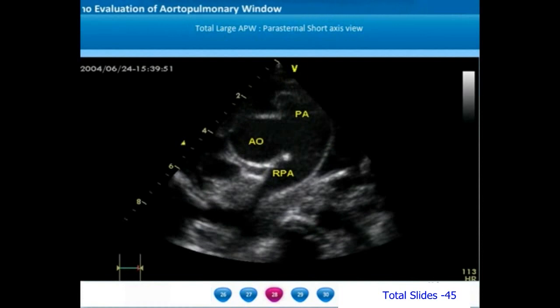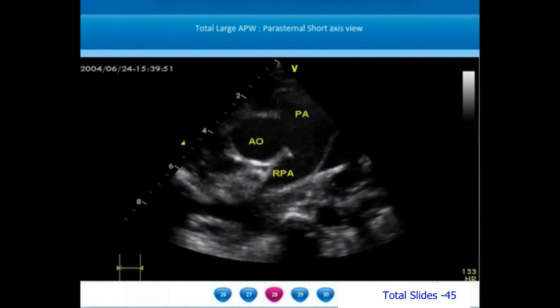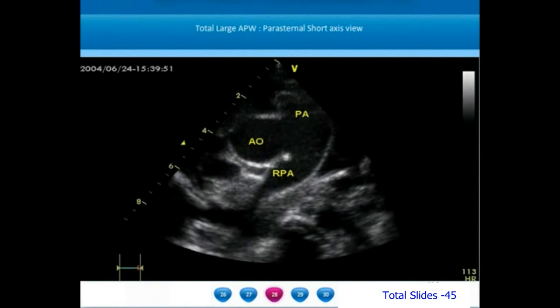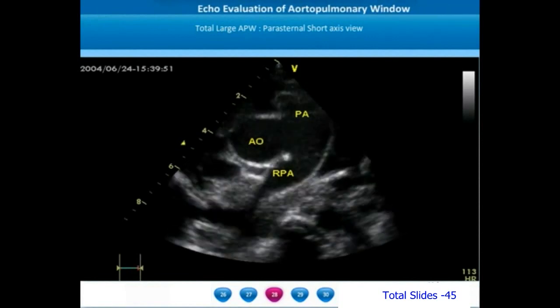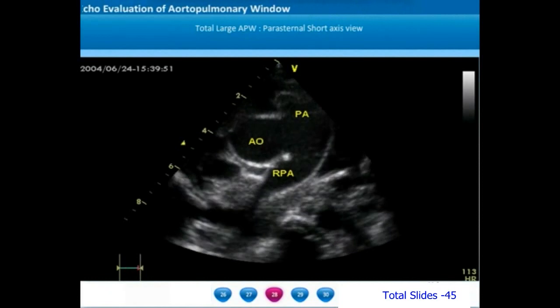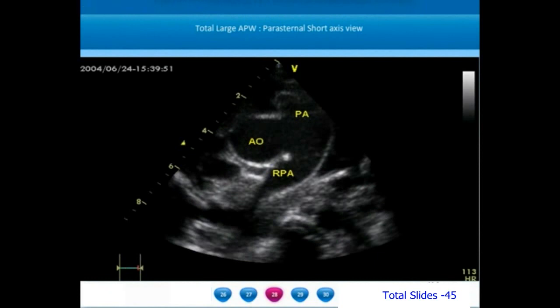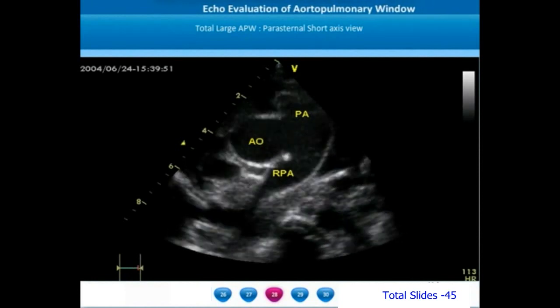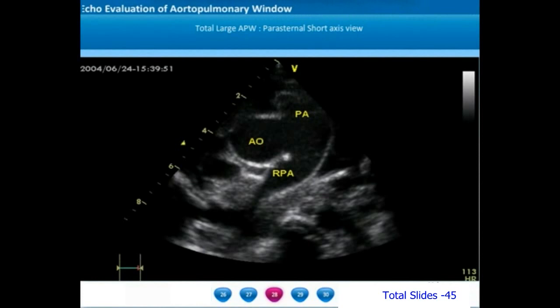We have so far seen one example of a restrictive proximal aortopulmonary window and two clinical examples of large non-restrictive distal aortopulmonary windows. The third type of AP window is called total AP window or type 3 aortopulmonary window. These are very large aortopulmonary windows that start almost close to the semilunar valve and extend distally almost up to the pulmonary artery bifurcation, satisfying the definition for both proximal and distal AP window.